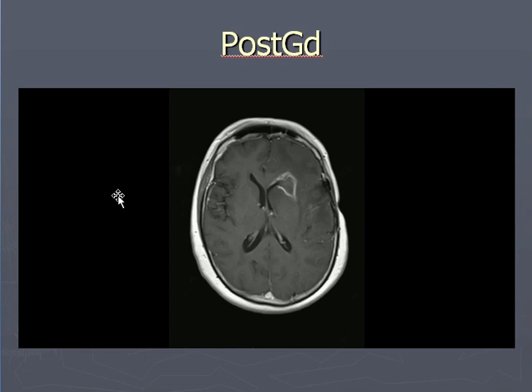Now you can see there is a structure in the frontal region which shows peripheral hyperintense rim. Actually this is a glioma, and the contrast was given, and this is outlined by the presence of the contrast in the periphery of the structure, periphery of the tumor.